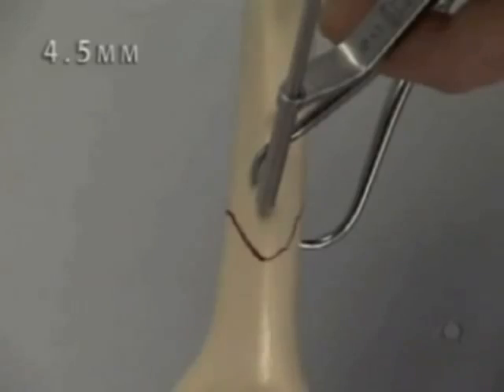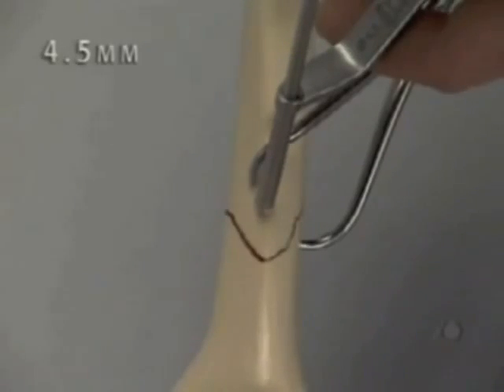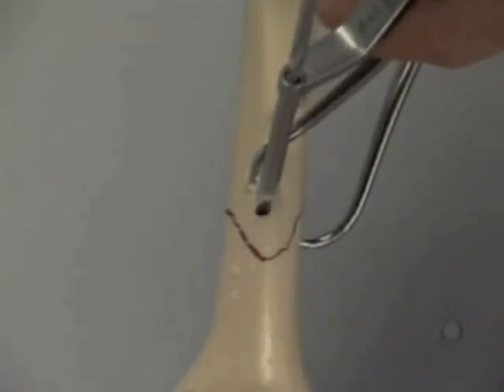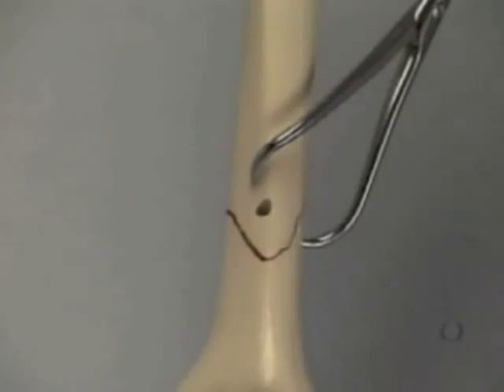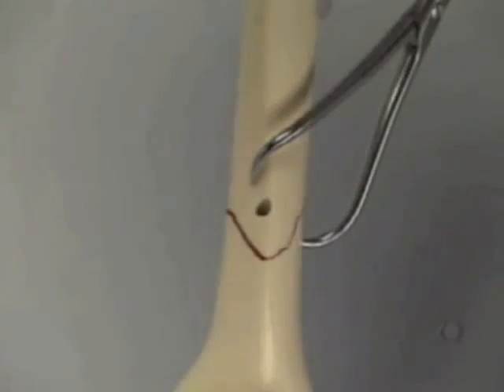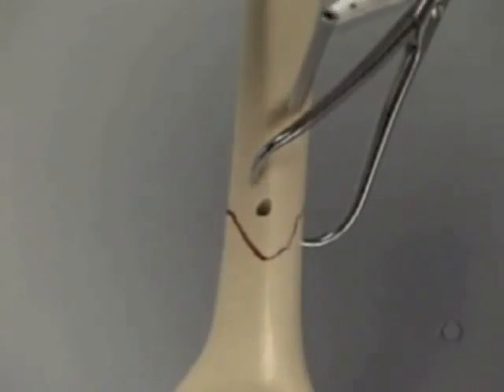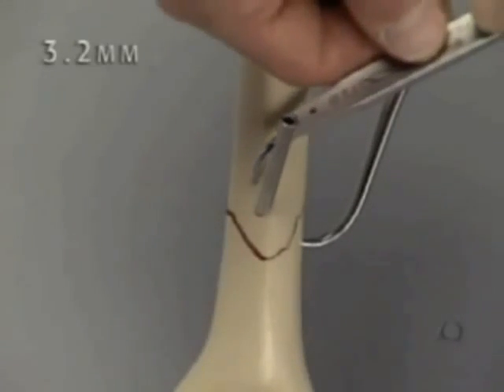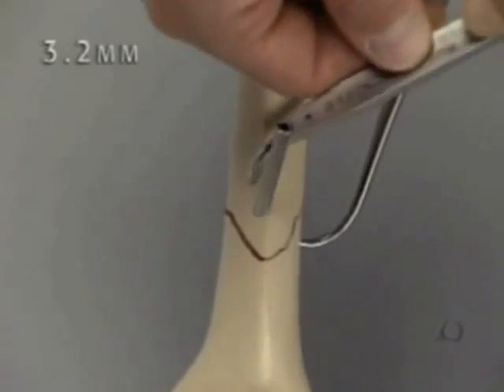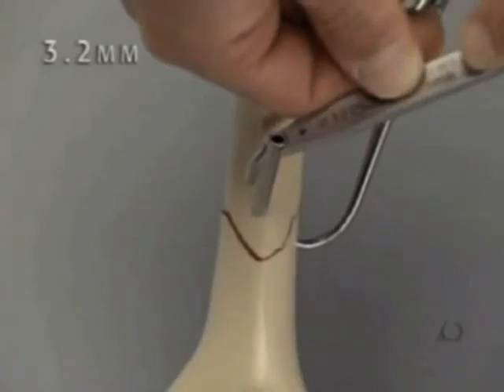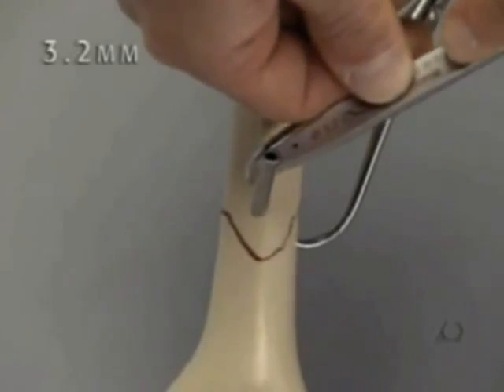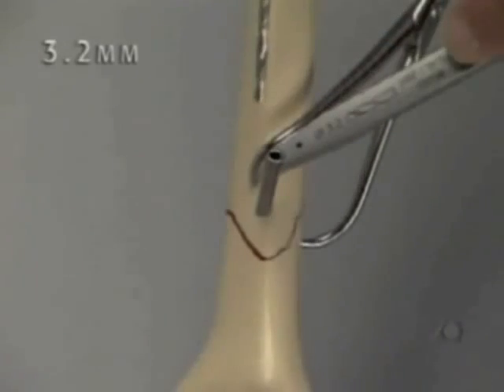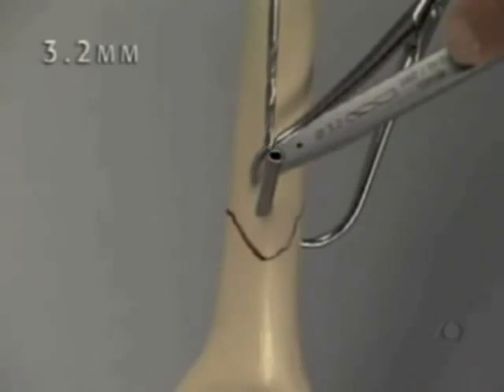The glide hole is drilled with the 4.5 millimeter drill bit and protection sleeve. The 3.2 sleeve is inserted into the glide hole and the thread hole in the far cortex is drilled with the 3.2 millimeter drill bit.